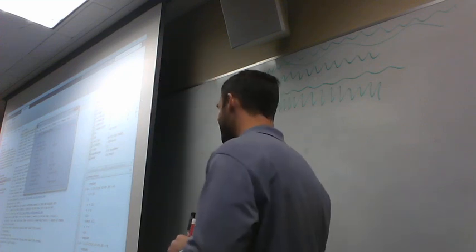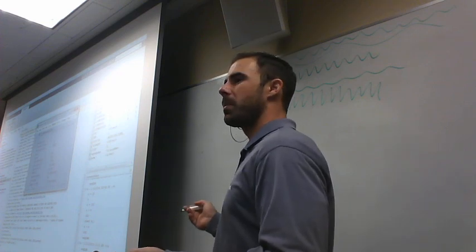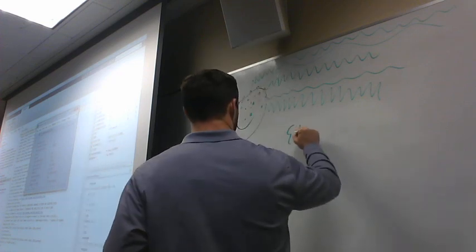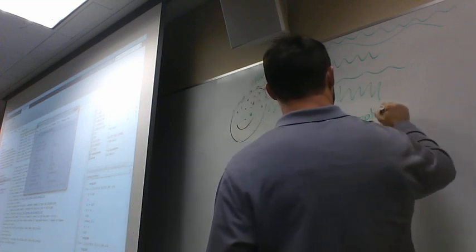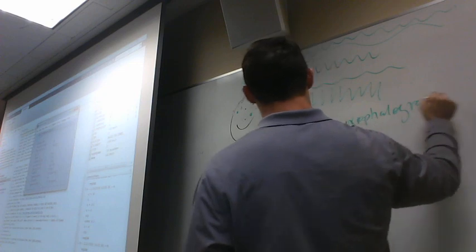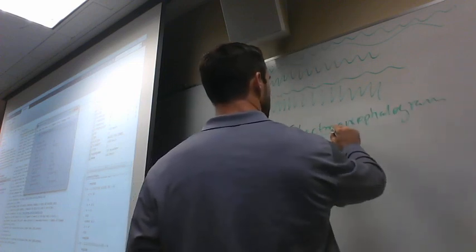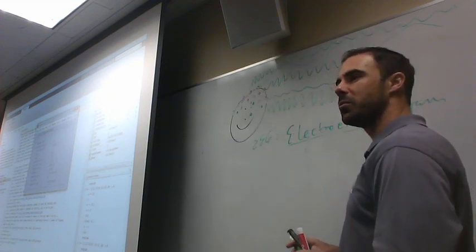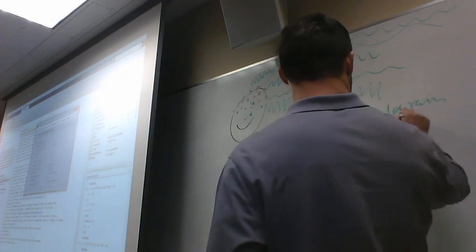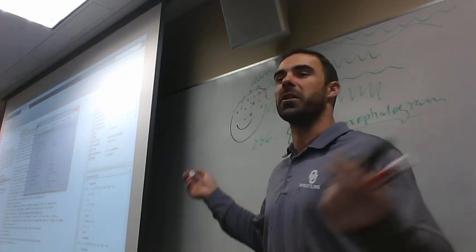Right, okay. So, EEG, what does that actually stand for? Electroencephalogram, right? Electroencephalogram. We shorten that to EEG, okay? Electro, encephalo means what? Brain, right? So Greek etymology for brain. And gram, of course, means measurement, okay? So it's measurement of brain activity.